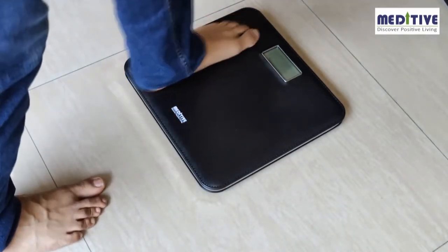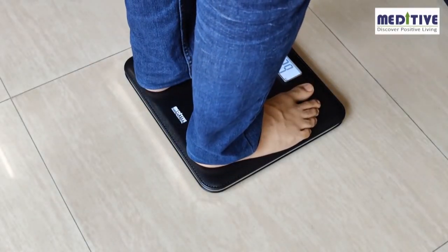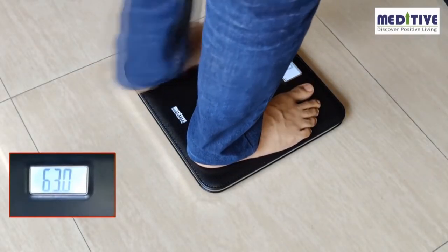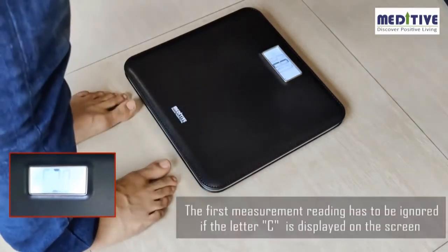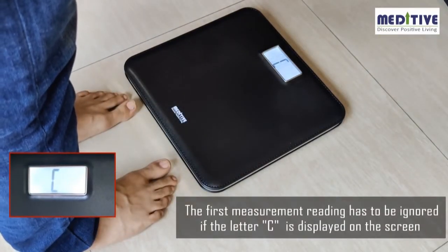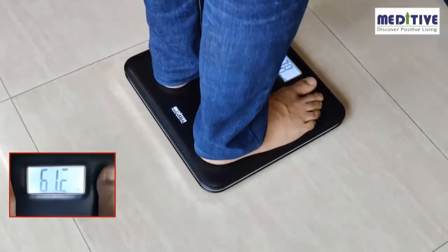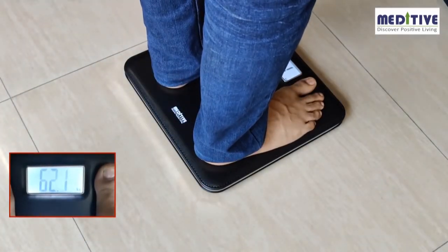Please note that whenever the scale is kept on the floor, the first measurement reading has to be ignored because the scale calibrates itself on the first reading. After you take the first reading, if the letter C is displayed on the screen, it means you need to ignore that reading. Please take the reading a second time without moving the scale, and then you will get the correct reading.